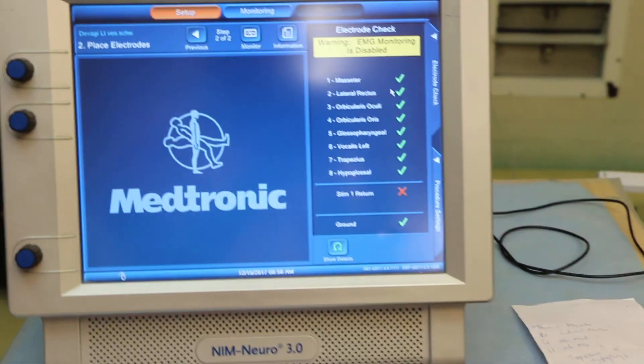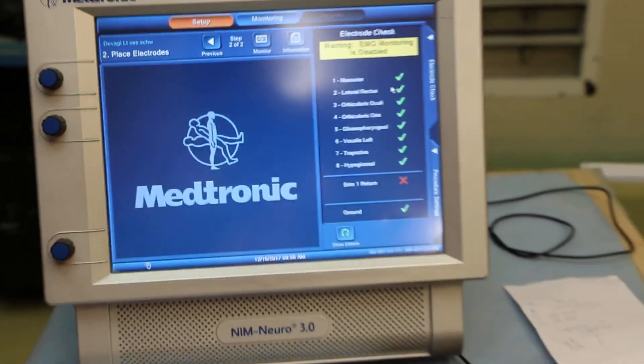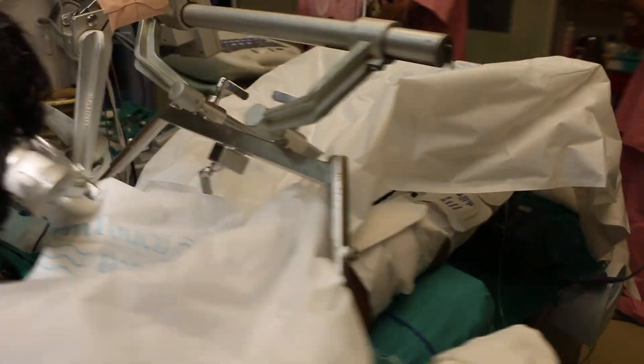This is the NIM 3.0 monitor in which we are getting all the leads confirmed and tick marked. That's great.